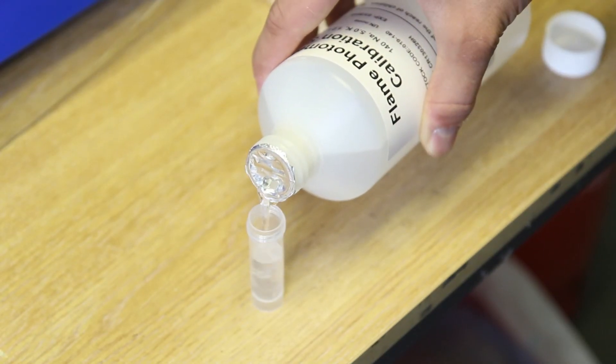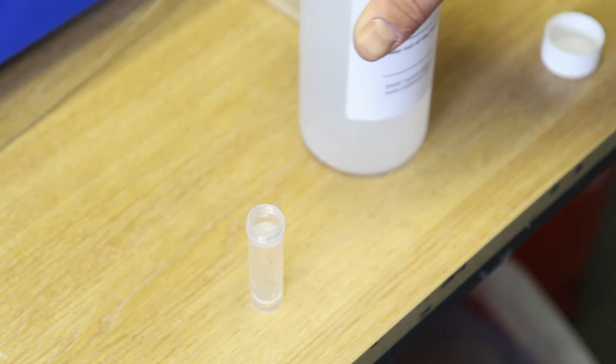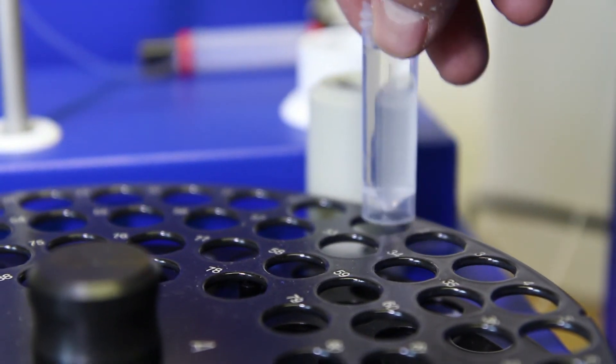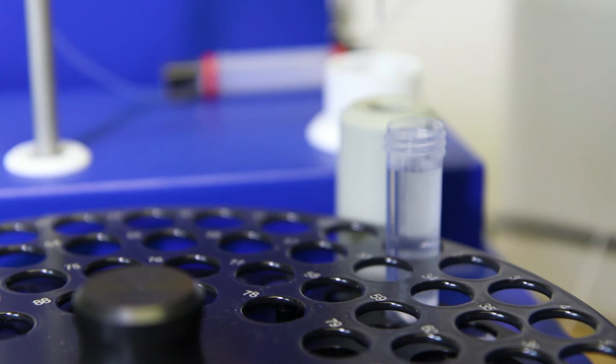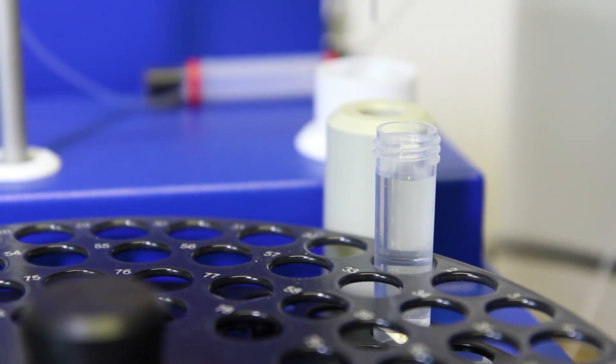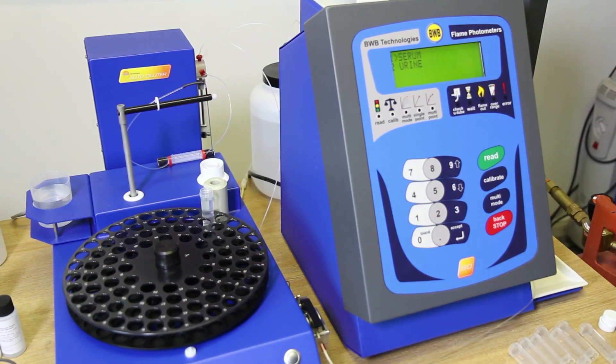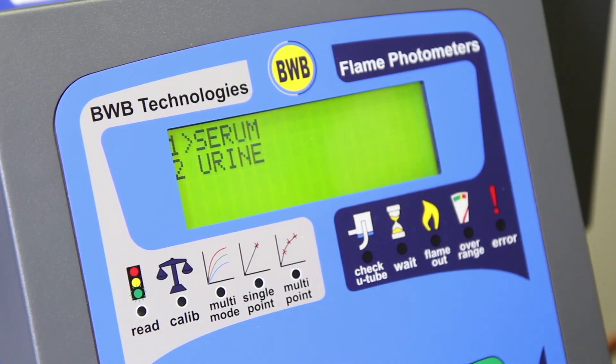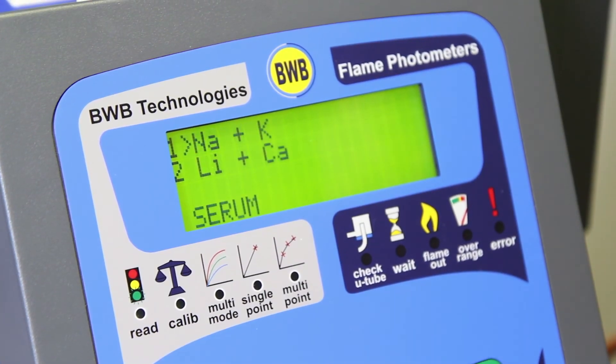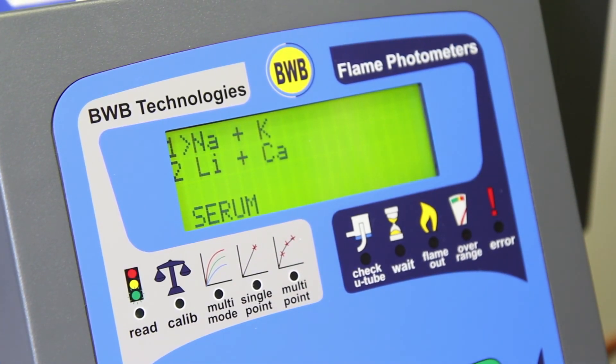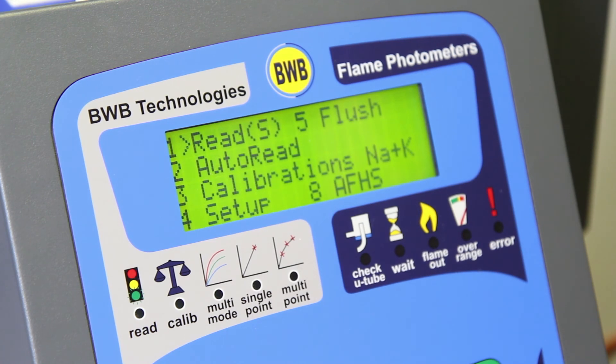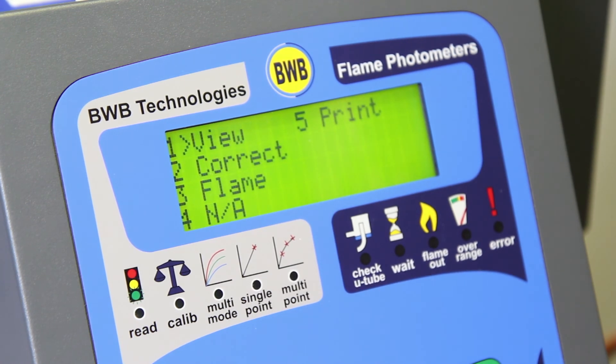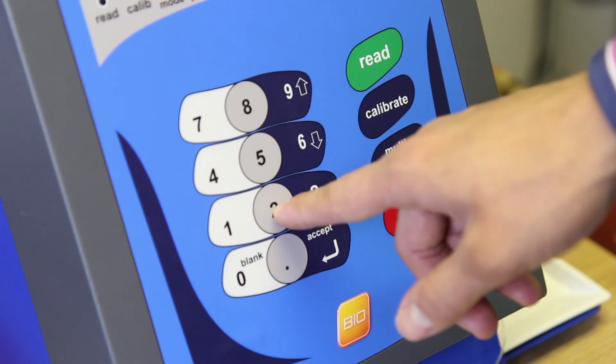First, pour the calibration solution into a vial and place in the first position of the AFHS carousel. From the BWB Bio main menu, using either the keypad or the up and down arrows, select Serum and press Accept. Now select Sodium Potassium. Select Calibrations. Select Correct. And finally select Correct Calibration.